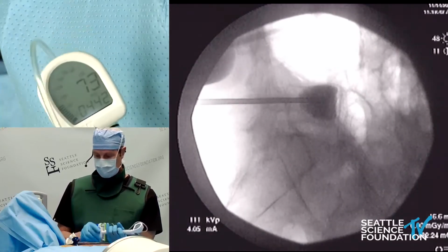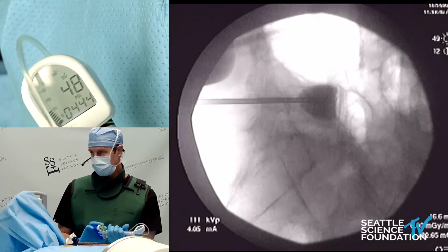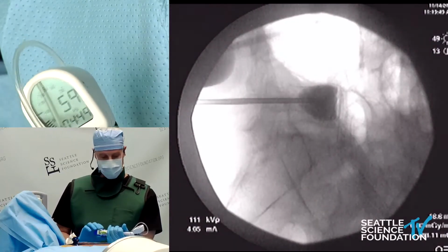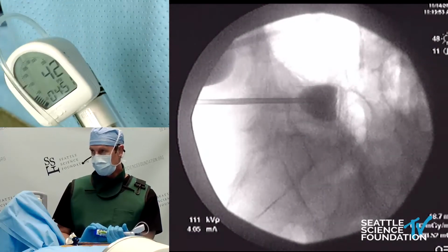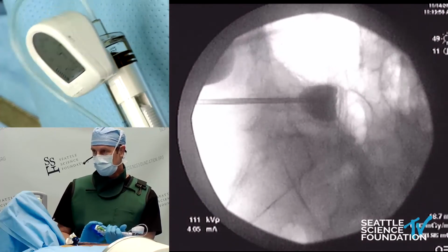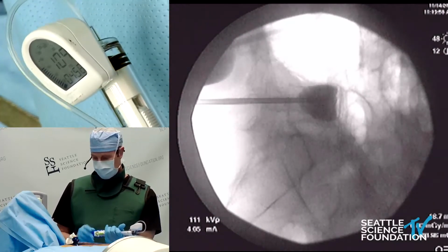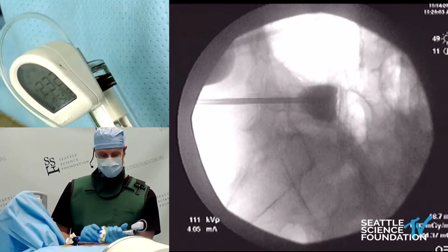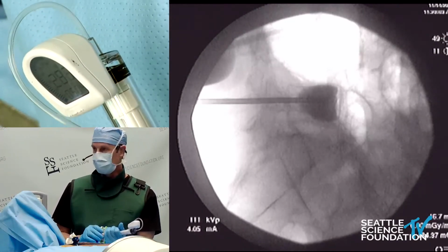So Phil, what was the total cement volume? So this is 10 cc's in the L5. Typically the amount of cement you'll want to use is 15 to 20% of the non-compressed vertebral body volume. It varies from person to person. The greatest amount of variation has to do with the fact that a person is either male or female.